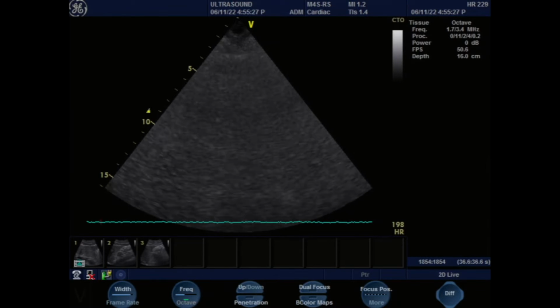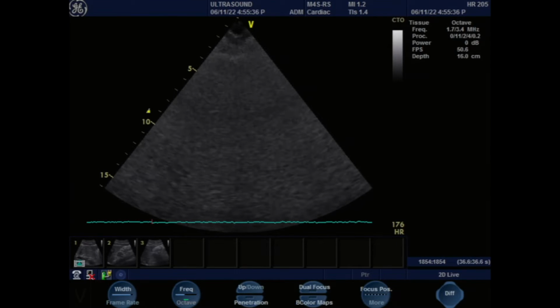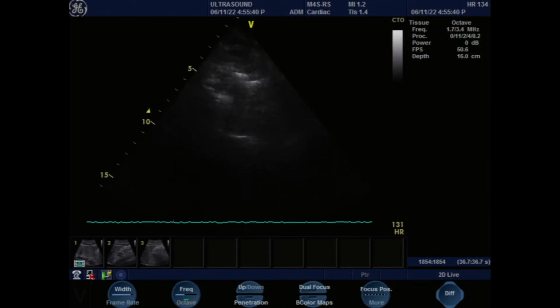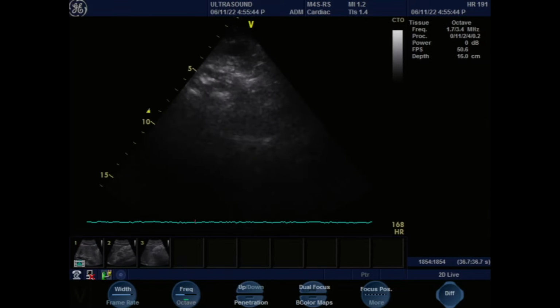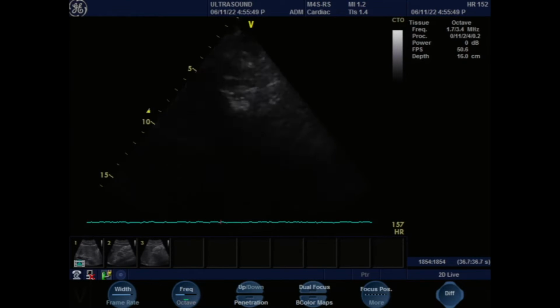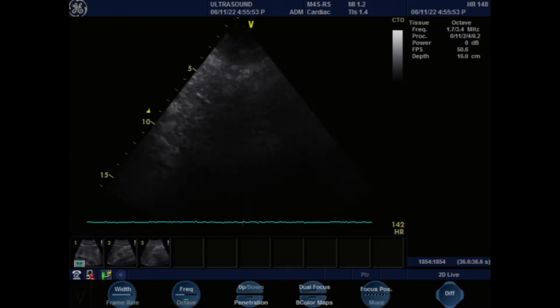Okay? So apical views are usually obtained where the apex of the heart is. If you think about him, his heart is over here, his apex is probably sitting somewhere over here. So what we're going to do is put the probe around there to see if we can get the heart in focus. A lot of times, if we turn you this way, then the heart drops, and we can get it more lined up here. So we can try to see if we can get anything from this view. If not, sometimes the depth needs to be adjusted too.